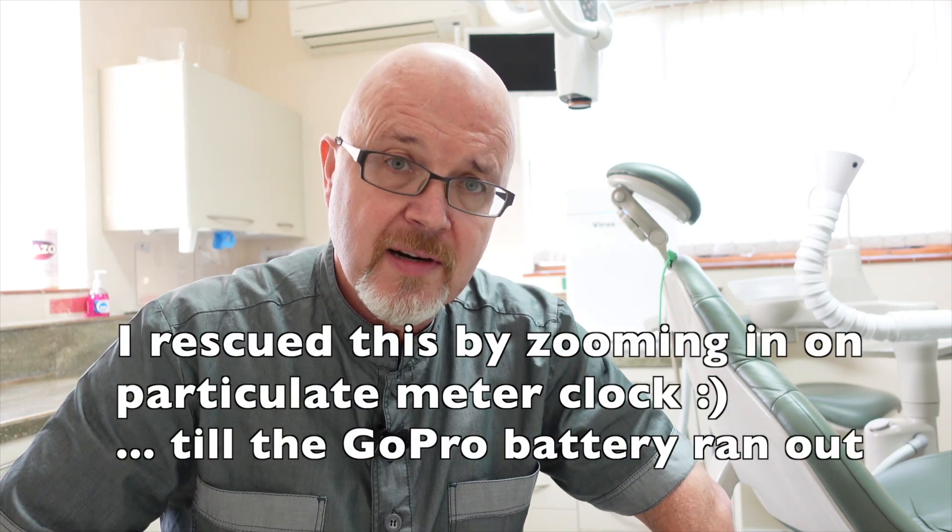I did record one today using the GoPro. Obviously it felt really strange not working through the Aeroshield, because I feel that reassurance of working the other side — effectively a visor that's got suction underneath it drawing away the aerosol. Sadly the GoPro was set up in hyperlapse mode so it's all in fast speed. It does show the amount of aerosol and we were hanging around for something like 45 minutes for the aerosol to settle.